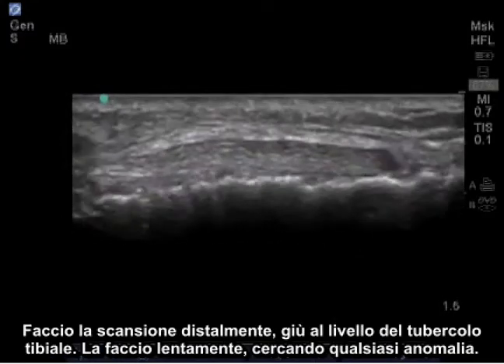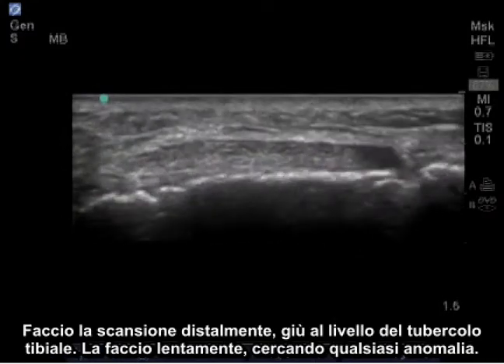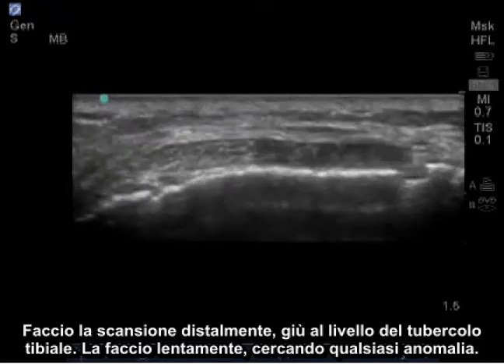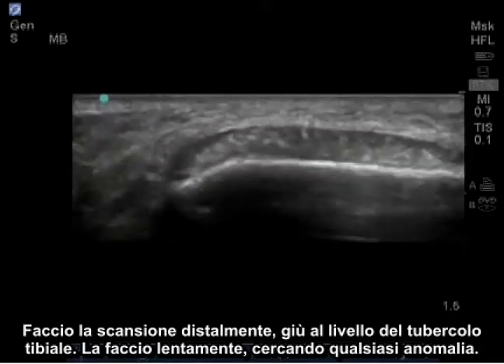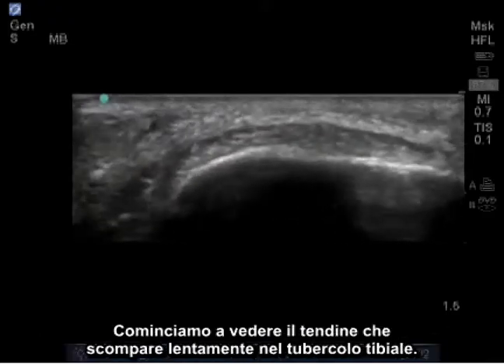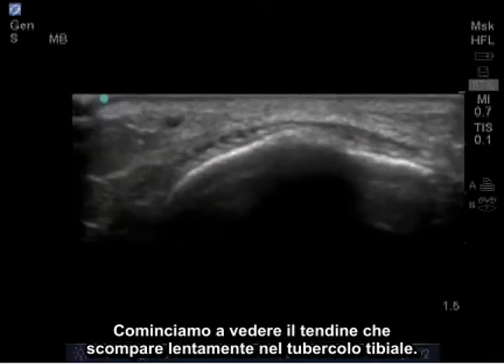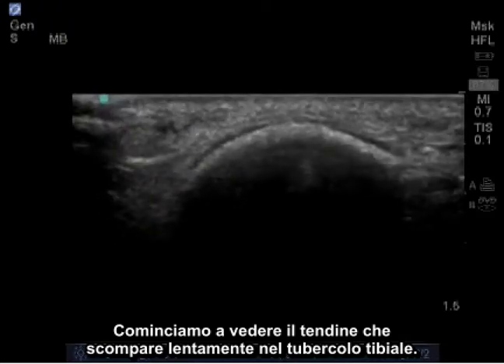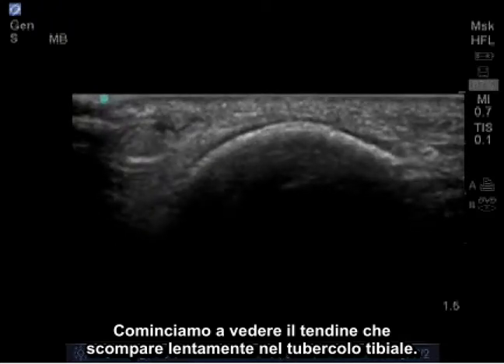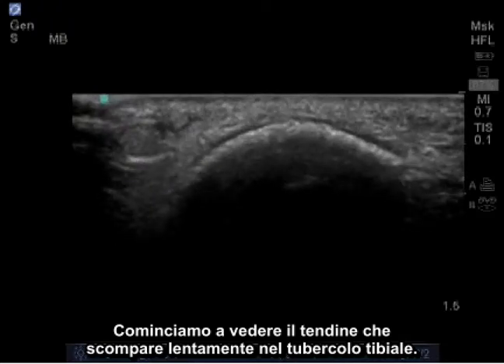I'm going to scan distally down to the tibial tubercle, slowly looking for irregularities. We'll begin to see the tendon slowly disappearing into the tibial tubercle.